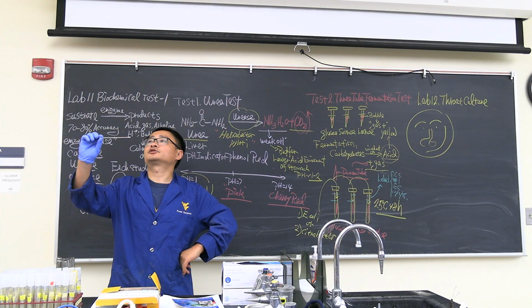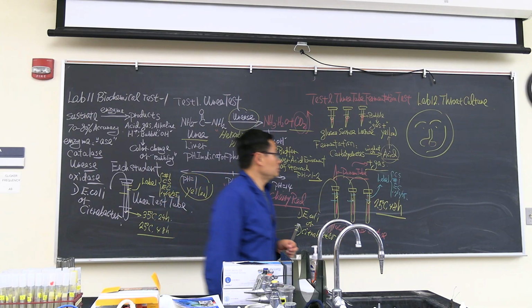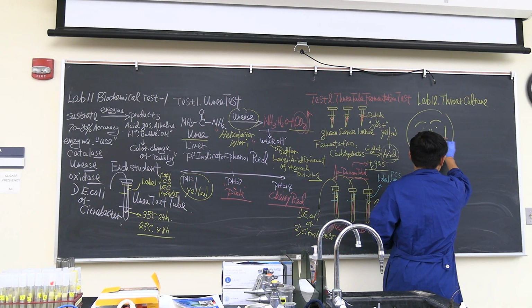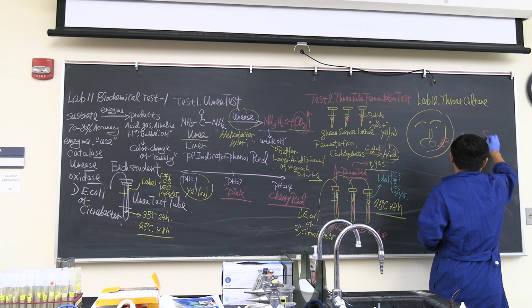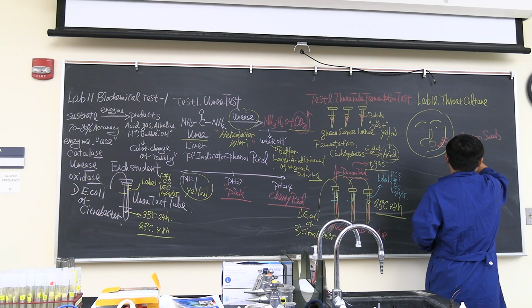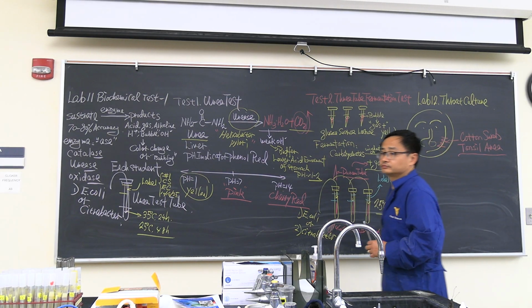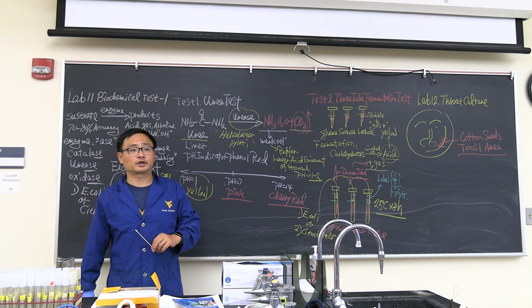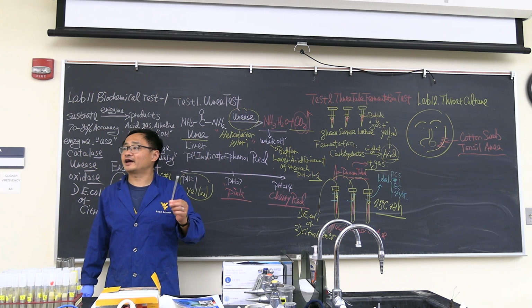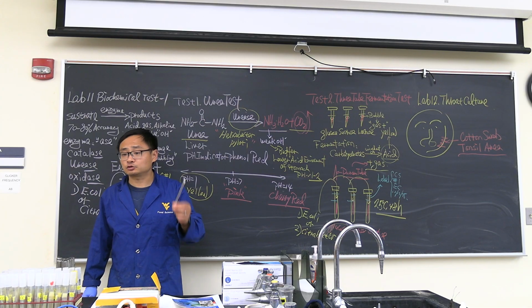Open your mouth, say ah, and you need to get the sample from the tonsil area. Be very careful, it needs to be the exact tonsil area. It's not your oral cavity, not the teeth. Why? We'll have an exam on Tuesday, so you need to know.